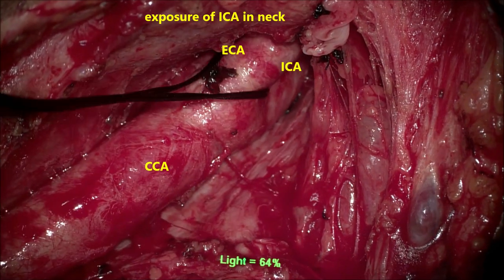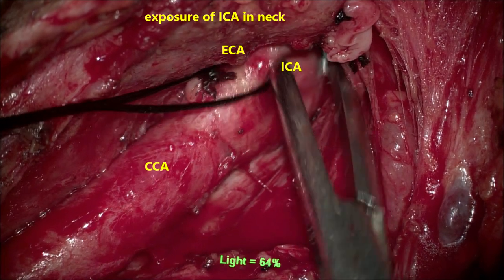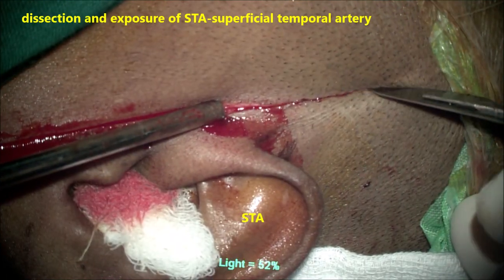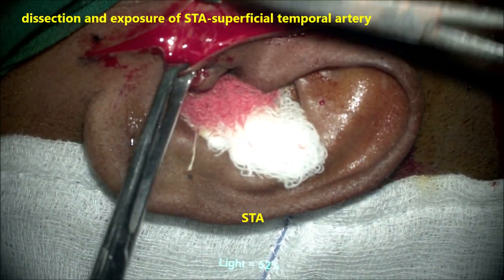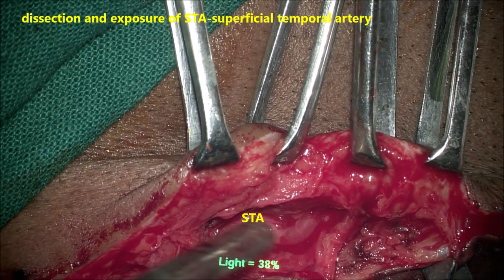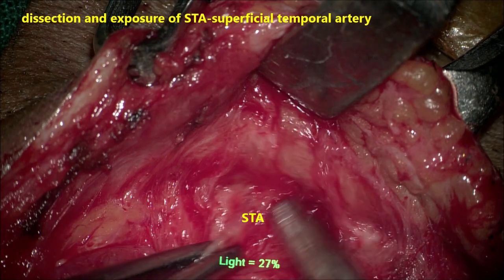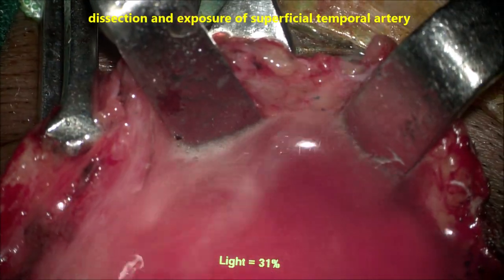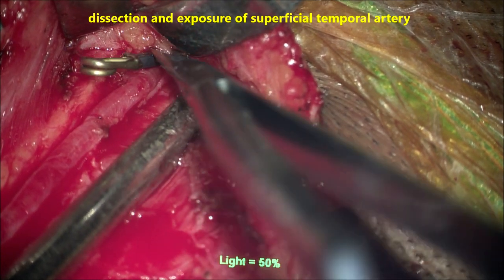These are the steps of exposure of the common carotid artery and internal carotid artery, kept ready for obliteration at a later stage. First, we expose the common carotid artery and internal carotid artery and keep it ready. Next, we harvest the superficial temporal artery graft and keep it ready, as shown here anterior to the tragus. A quite sufficient length of superficial temporal artery is taken so that we do not fall short at anastomosis. The anterior branch was quite large, exposed well, clamped, and harvested.